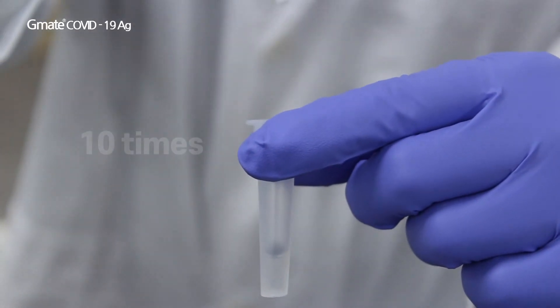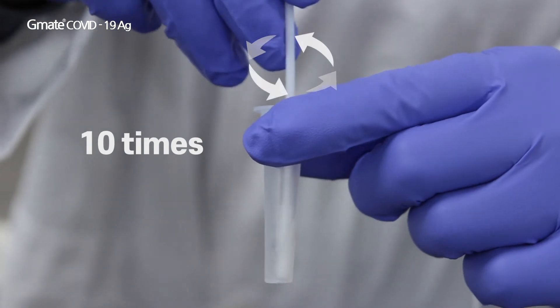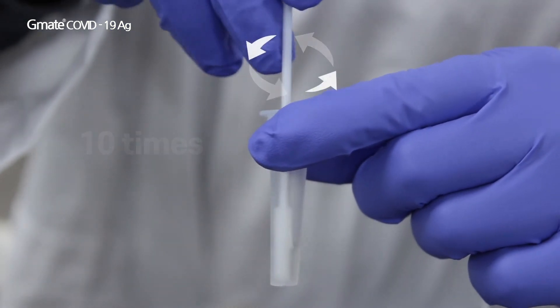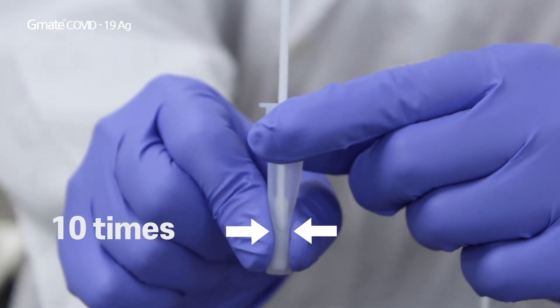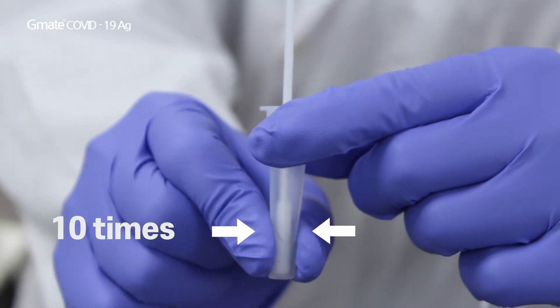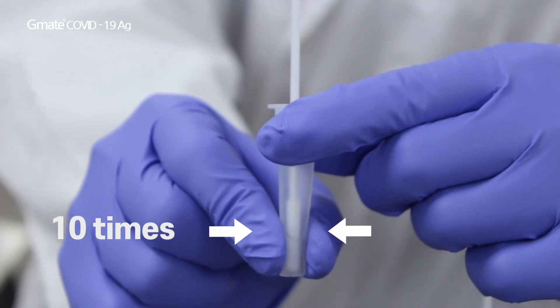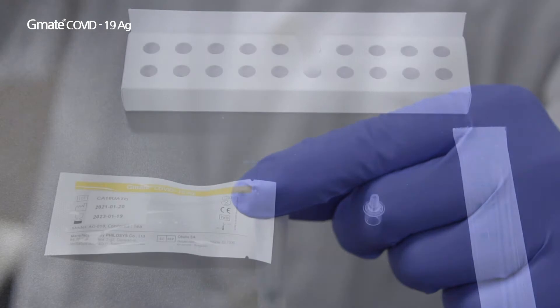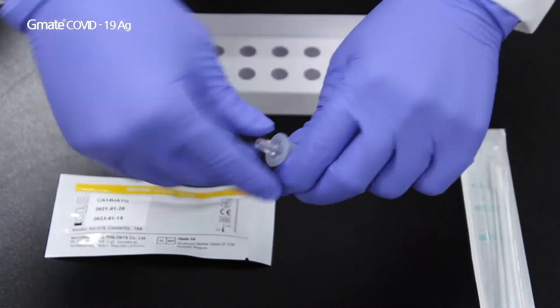Place the swab into the extraction vial and ensure the reagent fully permeates the head of the swab. Rotate the swab 10 times and squeeze the sampling tube 10 times as well. Remove the swab and close the sampling tube with the dropper cap tightly.